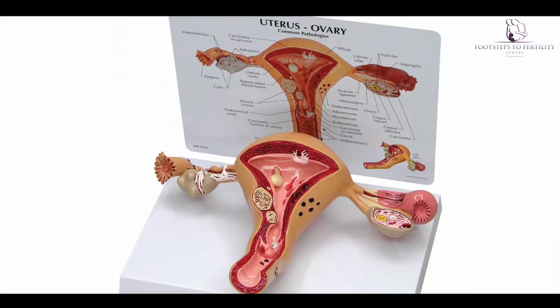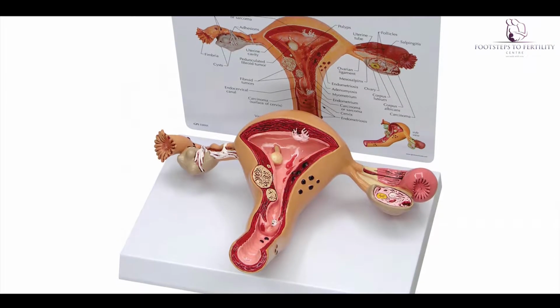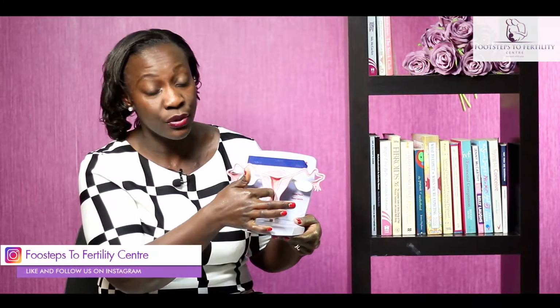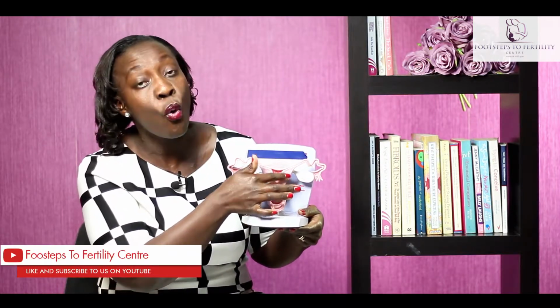So, what's a hysteroscopy? Very simple word. Again, I'll cut it down. Hystero means uterus. So, hysterectomy, everything means uterus. So, we're going to be talking about hysteroscopy, which hystero is uterus, and scopy means we're looking inside the uterus. So, what this actually means is that we pass a tube that has a camera inside the birth canal and up into the uterus. It's very microscopic, by the way, and in that we're able to visualize the whole uterine cavity.